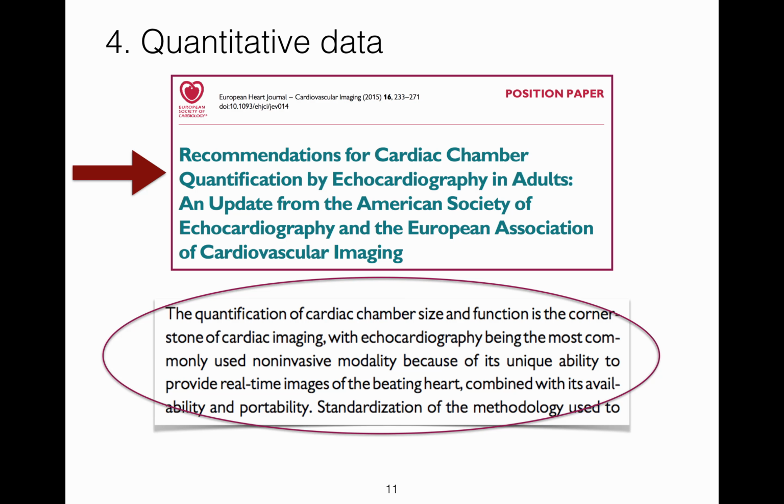Quantitative data. As you know, echocardiography is the most commonly used imaging modality in cardiology. One of the reasons for this is that it allows for the quantitation, that is, the measurement, of cardiac chamber sizes and their function. Quantitative data should be an integral part of every report.